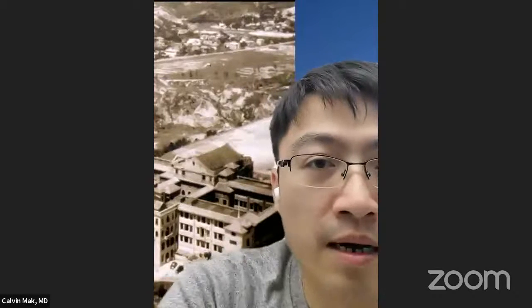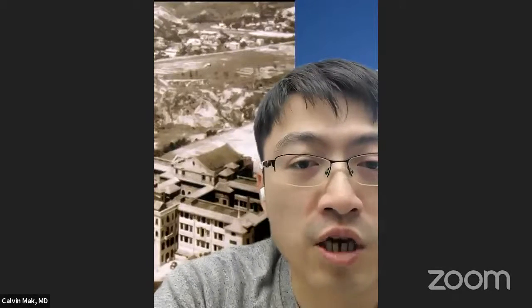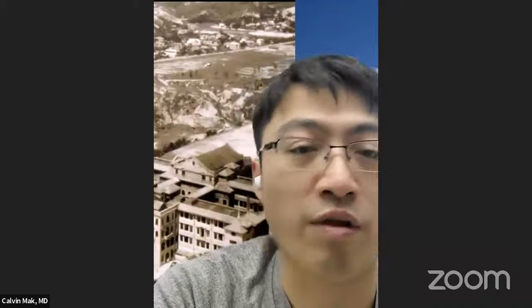I'm a skull base surgeon, both open and endoscopic. Just a comment and a question. First of all, your lecture is very informative, and with your vast experience, it's excellent. Congratulations on your excellent results as well. I want to echo your point that it's very important to have good irrigation during drilling to lower the temperature, especially when using the diamond drill. Otherwise, it can cause damage to the nerves, for example the optic nerve or the facial nerve when one is drilling along the fallopian canal. And also, it's the right way that we should use the larger diameter burr in the beginning instead of a small one. Otherwise it can be really easy for beginners and trainees to dig deep and then damage the structures there.